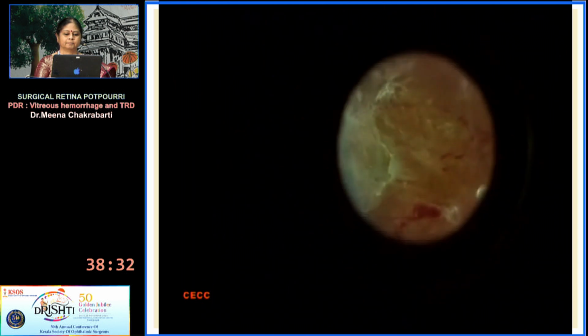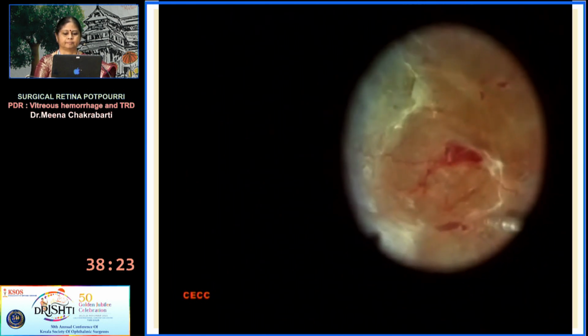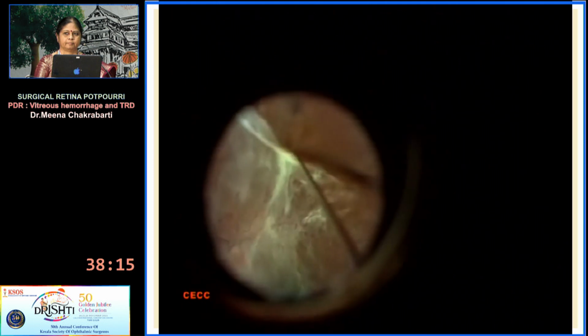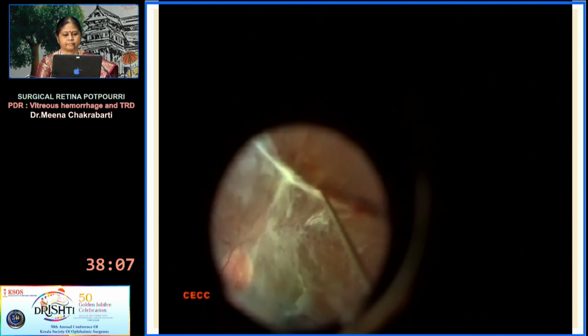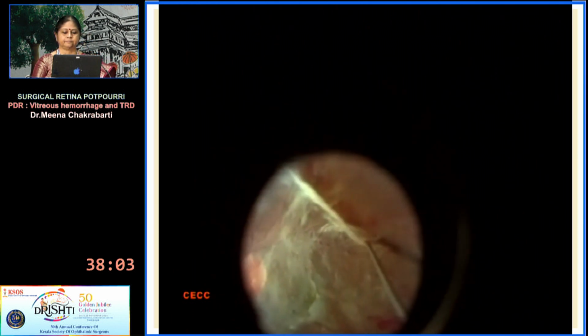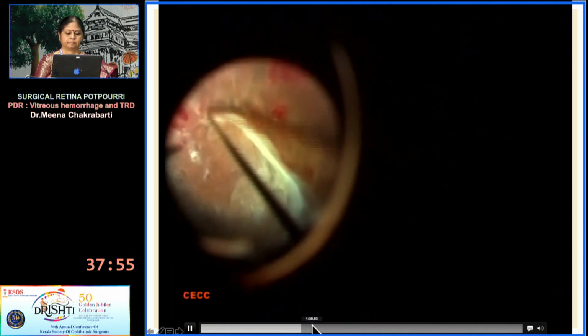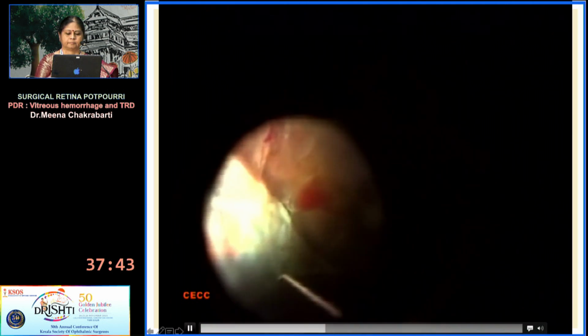The membrane dissection is started inferiorly after excising all vitreous attachments to the edges of the fibrovascular proliferation. A 23-gauge knife spatula is used to sever the vascular nails anchoring the fibrovascular proliferation to the underlying retina. When the membrane has loosened sufficiently, it is segmented with a 23-gauge cutter.